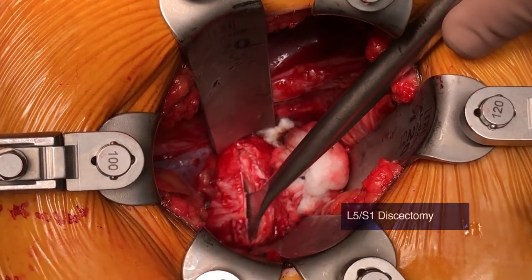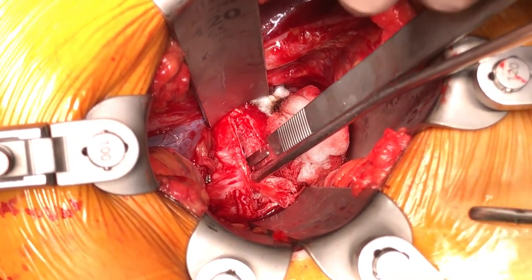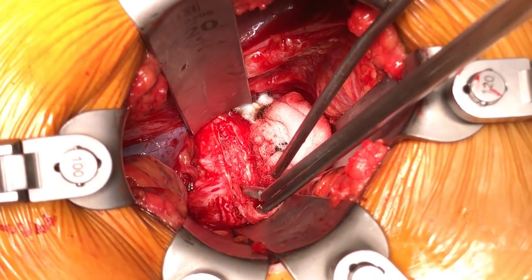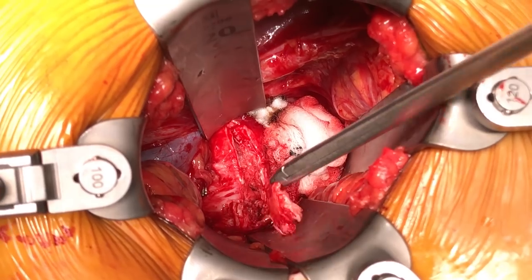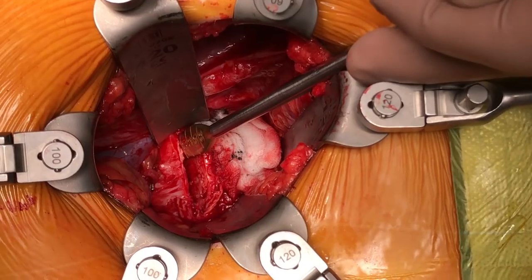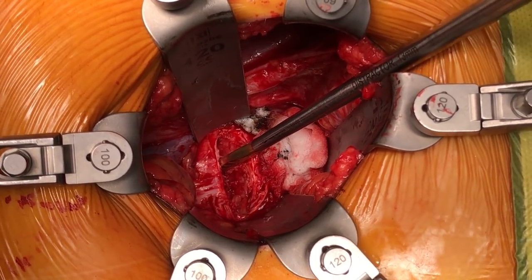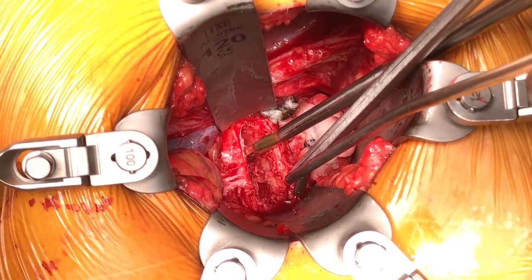Using a cob elevator, the plane between the bony and cartilaginous endplate is developed. Disc material is removed piecemeal using a pituitary rongeur. An insert-and-rotate distractor provides elevation of the disc height for efficient disc removal.